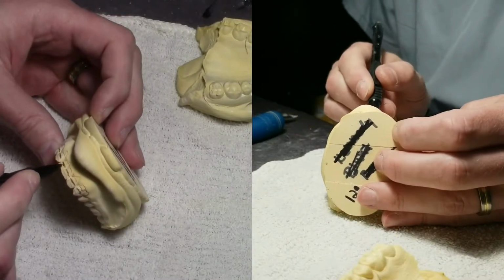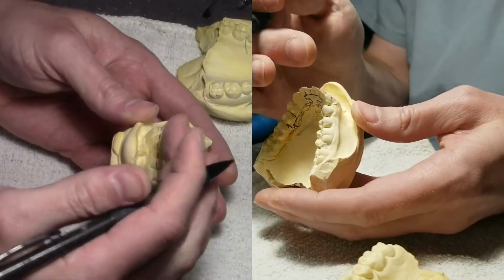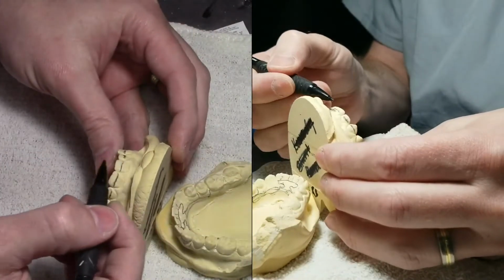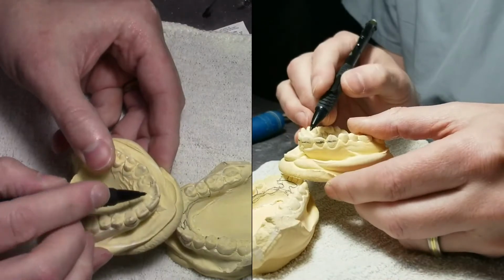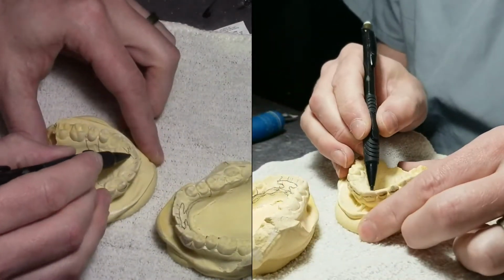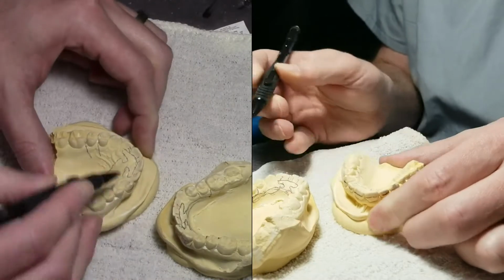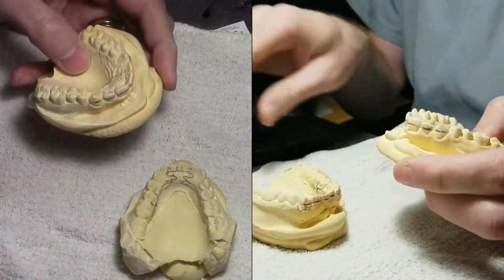And drawing these lines helped me when I go to reset to help keep the level, because you could change the level when you set this in wax and not know it. This I'm obviously going to have to bring down. So I've marked the teeth, I've marked the level, and this gets a mushroom spring also. And this is kind of how I bend my mushroom spring. Again, these are just reference marks for me.